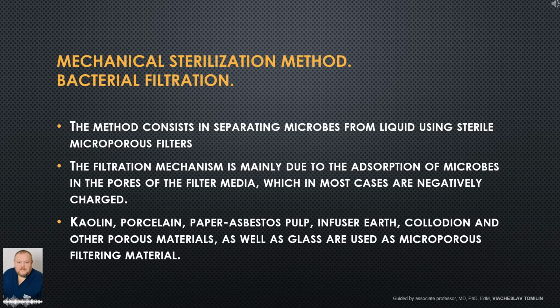Mechanical sterilization method. Bacterial filtration. The method consists in separating microbes from liquid using sterile microporous filters. The filtration mechanism is mainly due to the adsorption of microbes in the pores of the filter media, which in most cases are negatively charged.